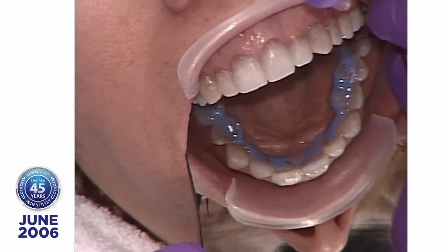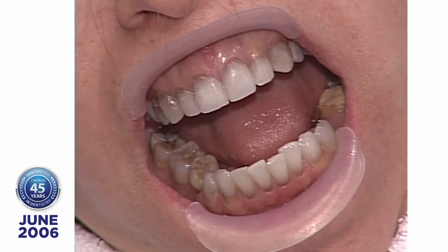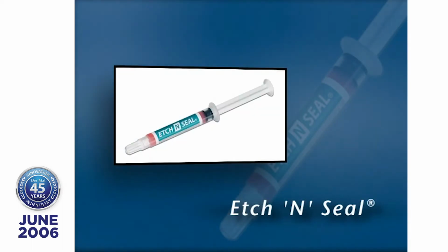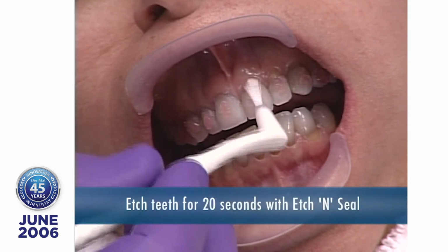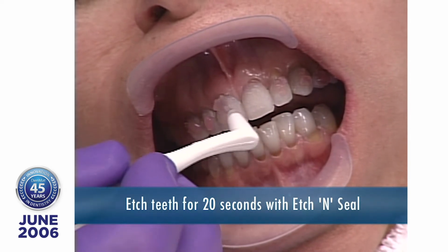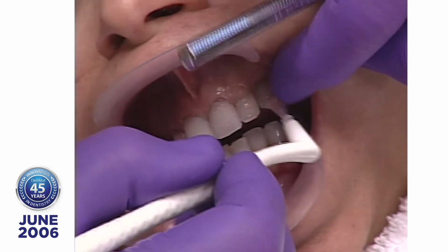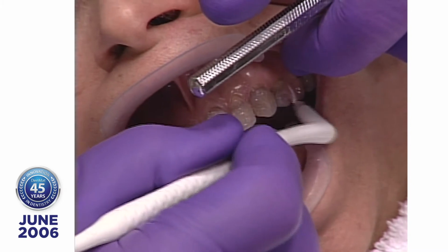Wherever that blue is, we're not going to have any Ultrabond bonding through the tooth. It'll greatly simplify finishing. Now I'm using the medium viscosity Etch and Seal. I like the medium viscosity. If you'll notice, I get to push it around exactly where I want it to be, and I have complete control. It doesn't run all over her mouth. Okay, just turn over this way just a bit. And I'll show you how to handle these dark bands of tetracycline stain when we get to that stage.